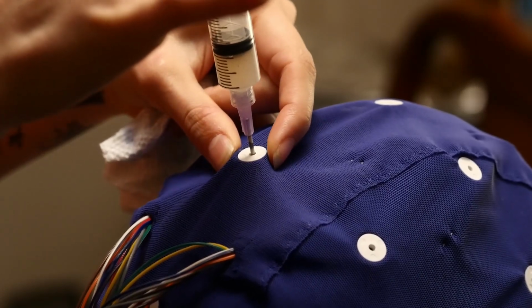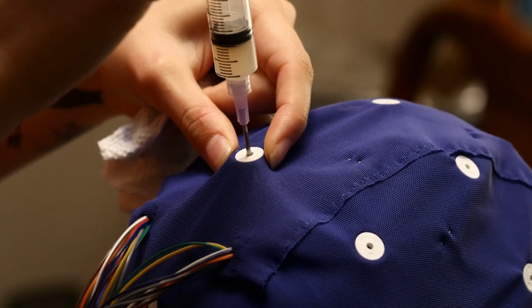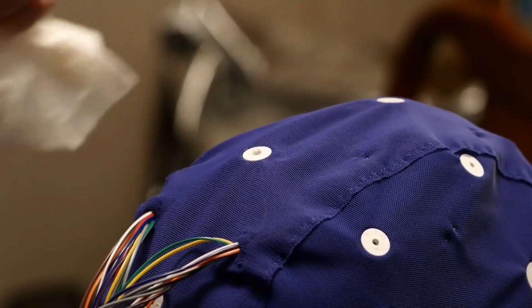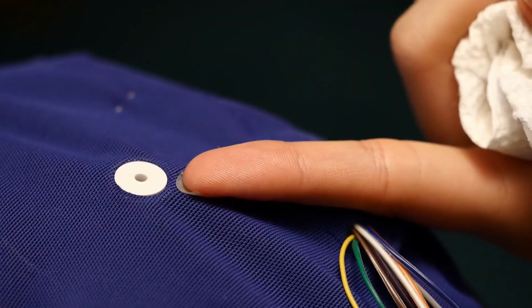And the amount of gel you can see here is infinitesimal. It is a very tiny amount of gel that's going to be injected. And then again, both are going to be settled back down onto the scalp with a twist and a wipe. And that is it. So let's see how much gel this really takes.